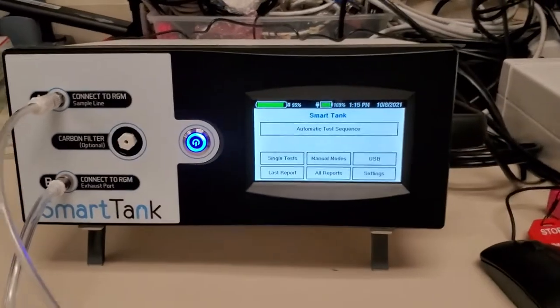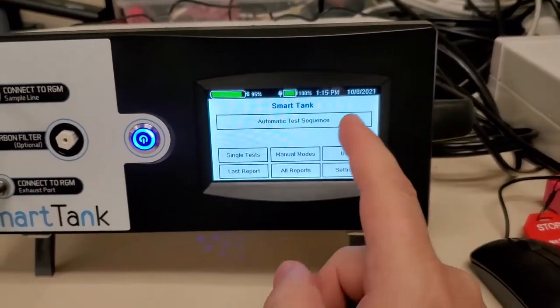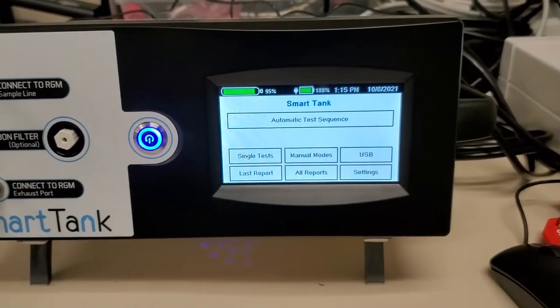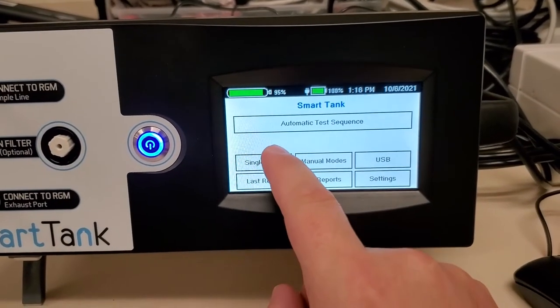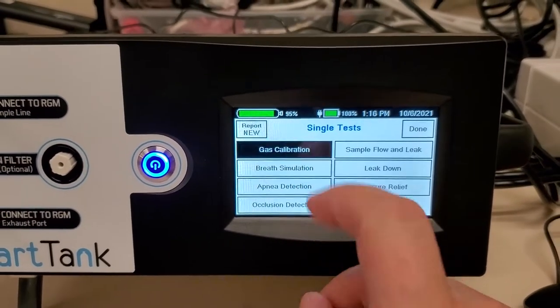This one's been plugged in, it's ready to go. Let's walk through the process. Here's the smart tank. You have the option of running automatic sequences, but we're going to go into single test, and from here we can go straight into gas calibration.